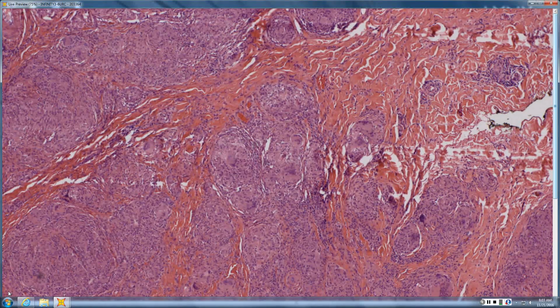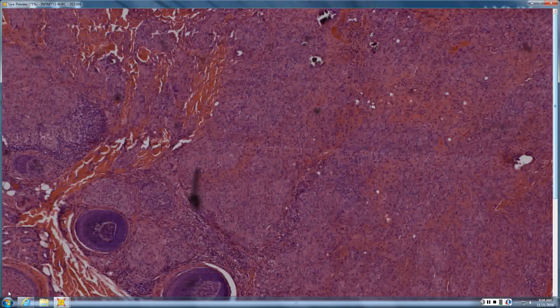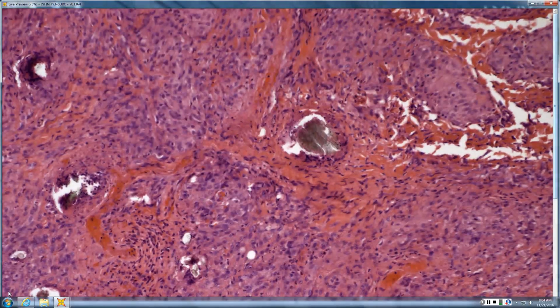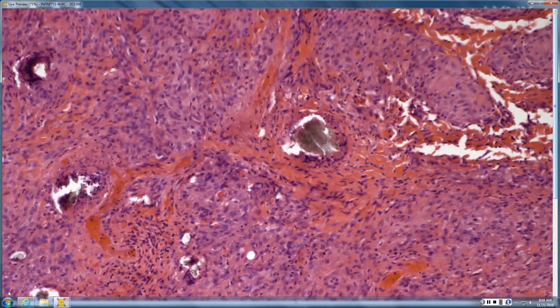So do you think it's a fair assessment to try to differentiate foreign body from sarcoid in this situation? Did you see the giant brown chunks of chalk? It was like suture in there or something. Let's see what we got. Like on not this cut, but right there, brown junk right there. What's that? That is hairs. Hairs? Trapped in the fractures. Yeah, exactly. So it's a destroyed hair follicle, and you got little hair follicle pieces. I thought that was the foreign body.